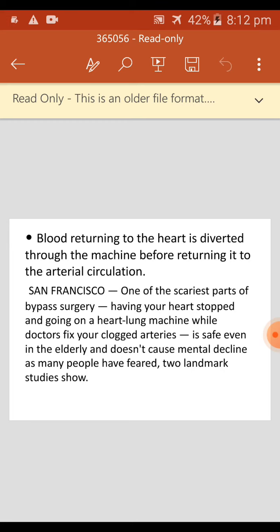The roller pump consists of a rotating pump arm with two attached cylindrical rollers and a pump housing into which a semicircular silicone tubing segment is inserted and then secured using special tubing insets. The rotating rollers alternately compress the tubing segment and deliver the liquid contained in the tubing in accordance with the rotational speed and direction. The exact adjustment of the two rollers determines the delivery.